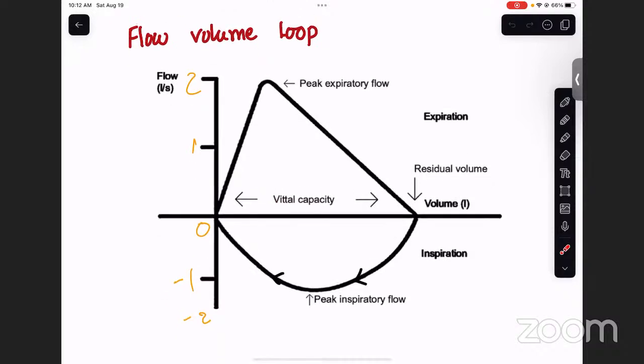In the flow volume loop, there is an inspiratory phase and an expiratory phase. Here you can see the inspiratory phase. It is an active process. Let's imagine that in inspiration there will be negative intrathoracic pressure in our body, so oxygen comes into our lungs, and the curve will be like this.